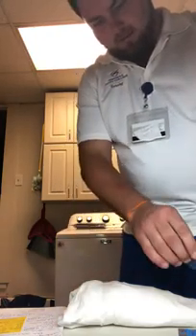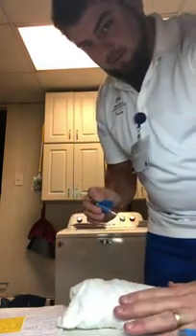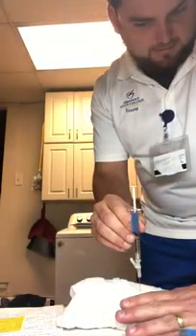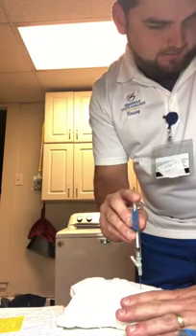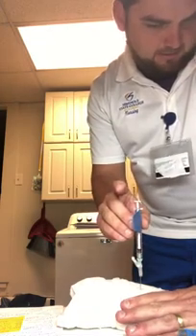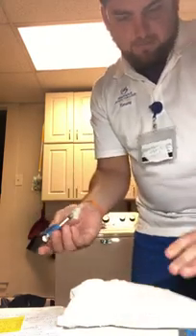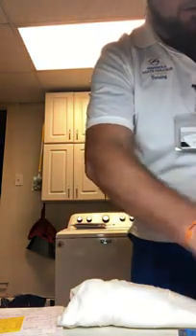All right, and we're going to remove the needle cap. I'm going to do the Z-track technique and pull it to the side, 1 to 1.5 inches. I'm going to go 90 degrees in, and we're going to slowly inject it and hold it 5 to 10 seconds. And after 5 to 10 seconds, we're going to pull the needle out and let go. And we're going to use our gauze here. We're going to recap the needle and put it in the sharps container.